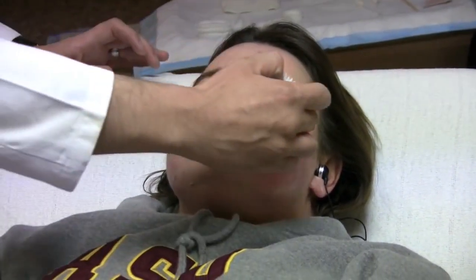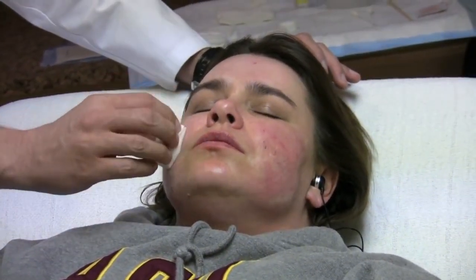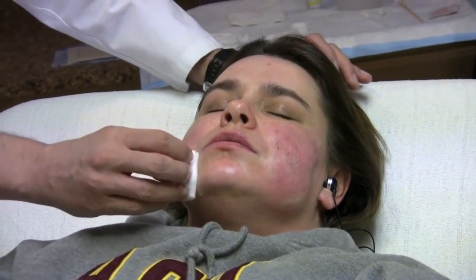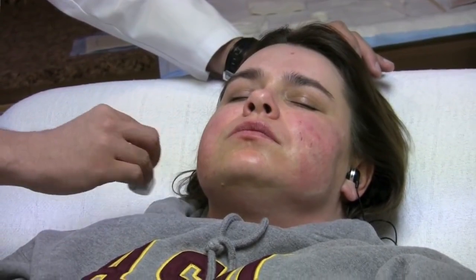Now you'll notice that there's some patchy whiteness to the cheeks, and a few little bruises. These are essentially from the numbing shots. About 10 minutes ago, I did upper and lower dental blocks, numbing her inferior orbital nerve as well as her mental nerve, and then numbing some of the zygomatic branches of the facial nerve as well, and then doing some local injections underneath the skin. This is to make sure we're completely numb for this procedure, because as I said, the phenol peel is extremely deep and you have to have numbing.